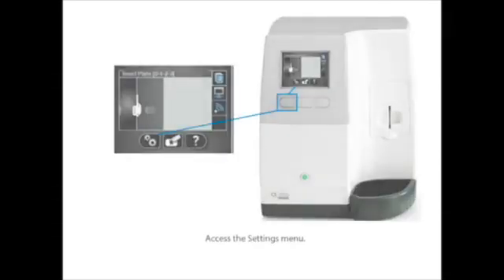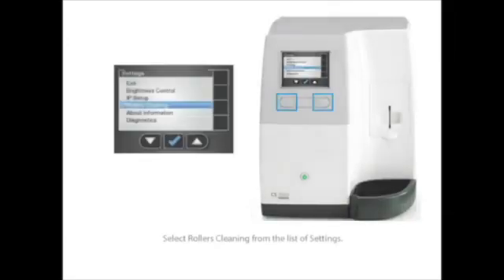Next, press the scanner's left function button to access the settings menu. The settings menu is indicated by the icon with the two slotted gears. Use the scanner's function buttons to select roller cleaning from the list of settings, then press the middle function button to confirm your selection.